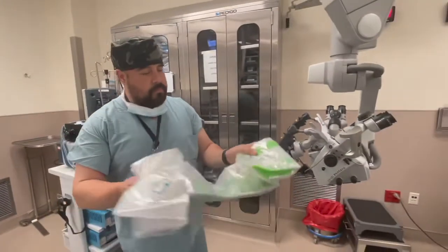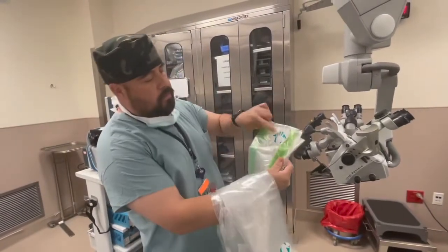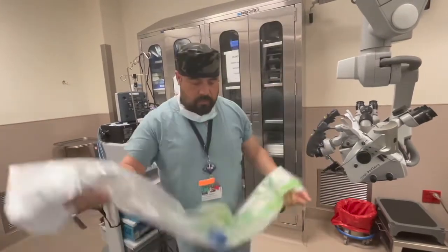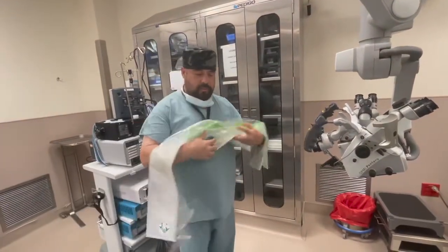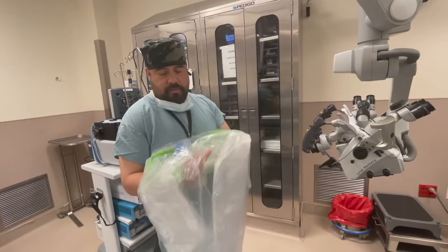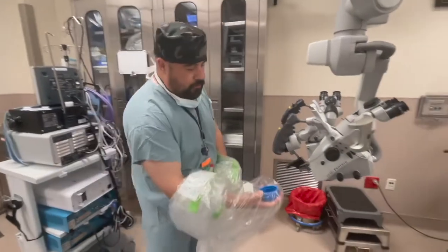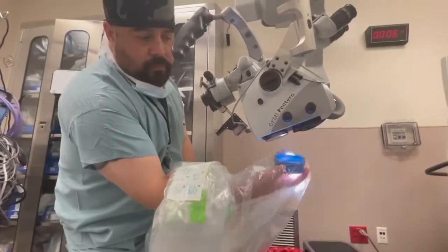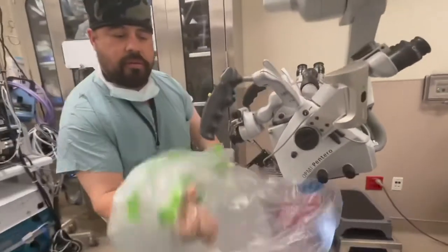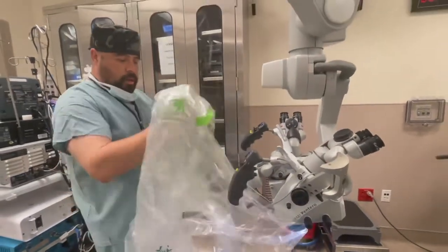So you grab the drape and you put it on your arms. Each side of the drape comes with a left and right side. Once you know that you have the left on the left side and the right on the right side, you go in the middle of the drape and you search for the blue adapter. The blue adapter will connect to the bottom of the microscope. Okay, like so. Once you connect it, you stretch out the drape a little bit so you can grab the handle. And once you grab the handle, you can control your scope.